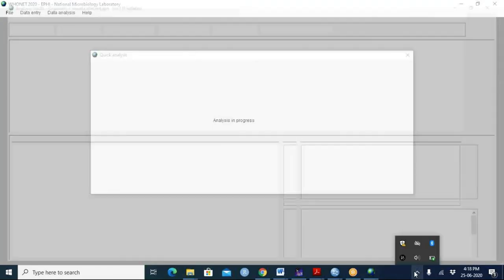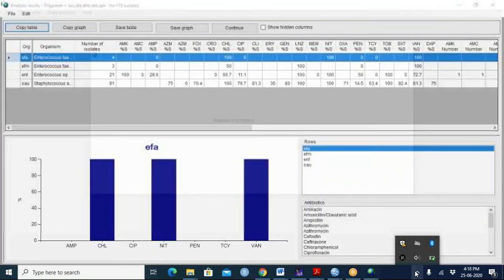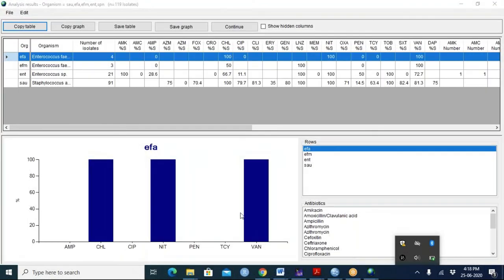Okay, and now we're going to do the antibiogram for some of the most important gram-positive pathogens, Enterococcus. I did not put all gram-positives. I just put some of the most important ones. Enterococcus faecalis, faecium species, and there were no strep pneumonia because I also put strep pneumonia on the list. Gram-positive organisms are very different from each other. Staph is very different from enterococcus. Enterococcus is very different from strep pneumonia. So let's have this discussion, but let's have it with the gram-negatives. Click on continue.